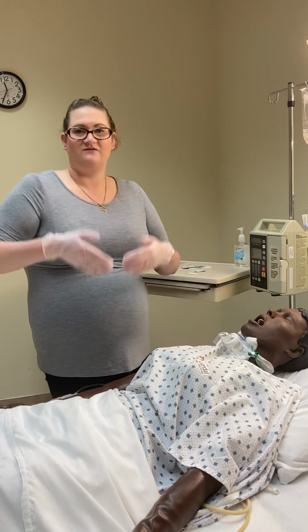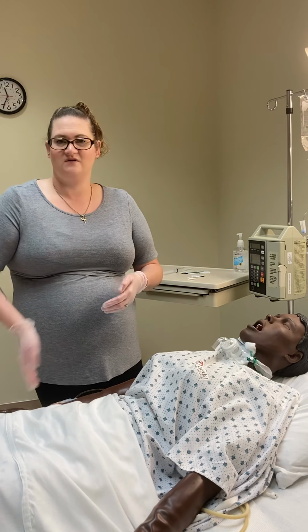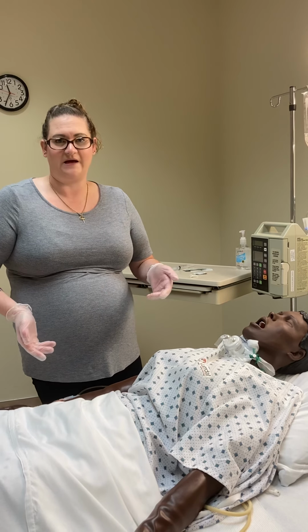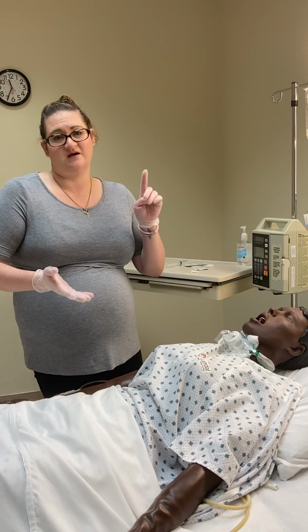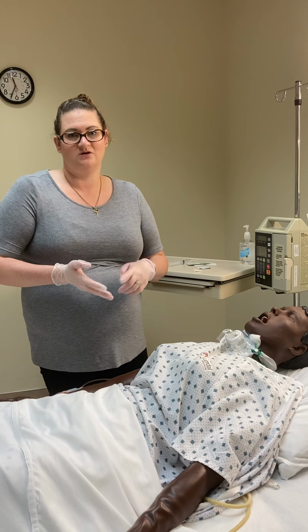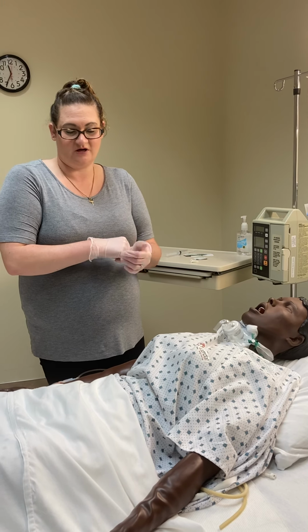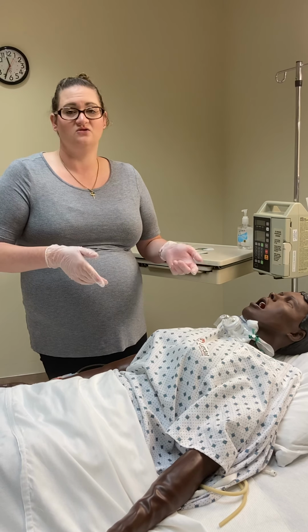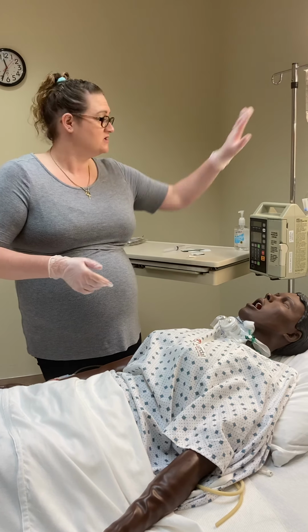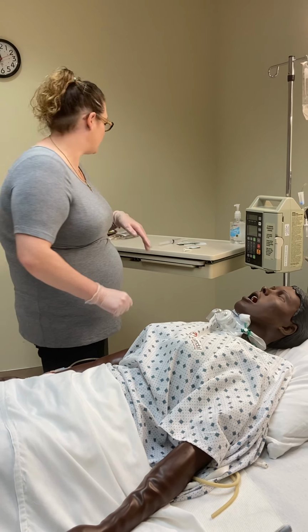If you don't check your IV for patency, you go and get your blood, you come back, the IV is blown or bad, then you're trying to find an IV in somebody who has low blood volume. They're probably hypotensive, so their veins are getting dehydrated. Finding a new IV is going to be a pain in the rear. So get this set up and going so that way it's ready to go when you get back.